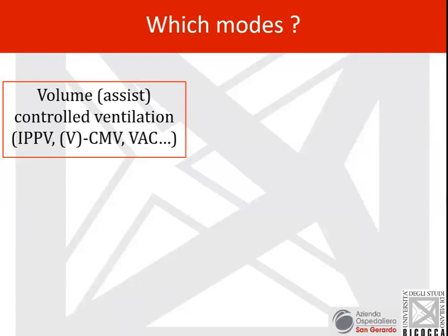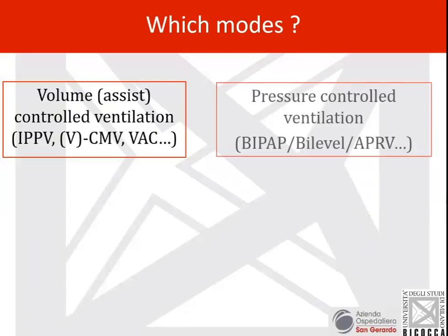So depending on which ventilator you will be working on, this ventilatory mode could be called CMV or IPPV, but basically the principle under which these ventilatory modes work is always the same. And then on the other side of the ocean is pressure control ventilation.